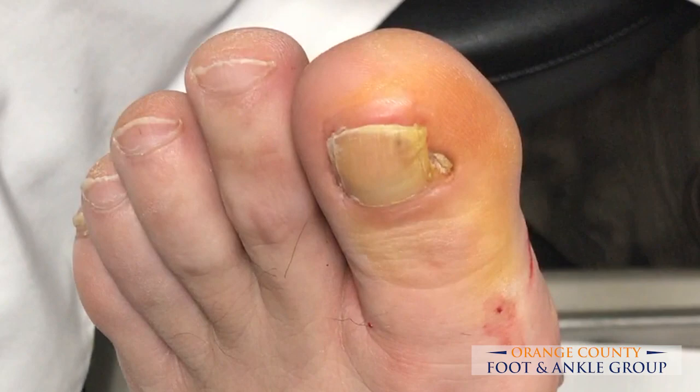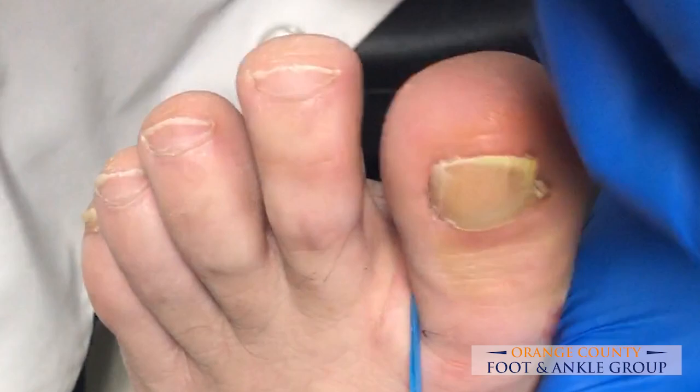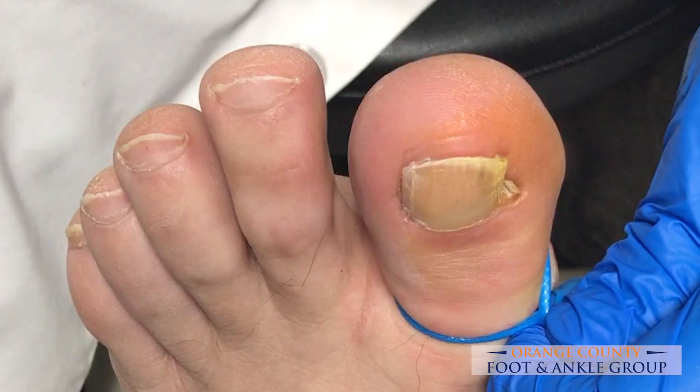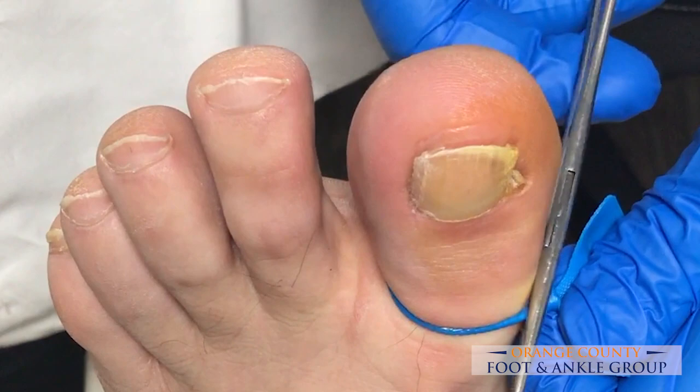He's already numb because we've already injected him with some 1% lidocaine plain, so his toe is getting numb. We're going to now put on our tourniquet so that we don't have a lot of bleeding. We do that with a little Penrose drain that we've cut down and our hemostat.